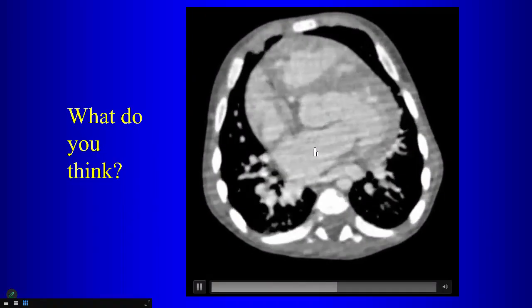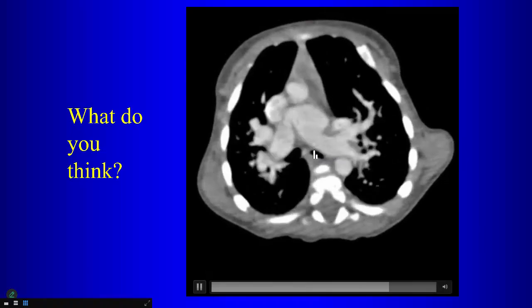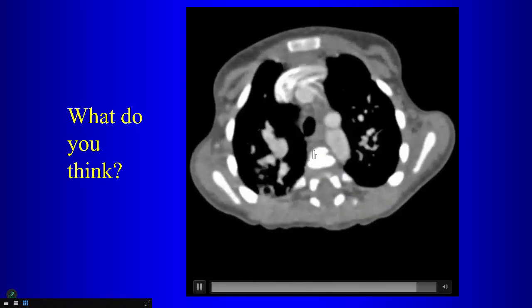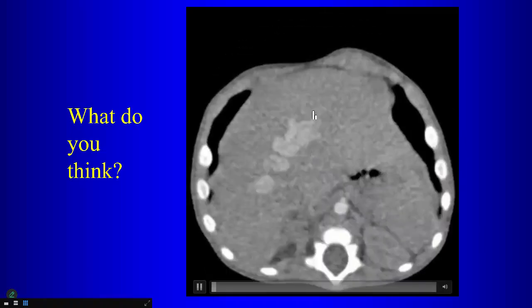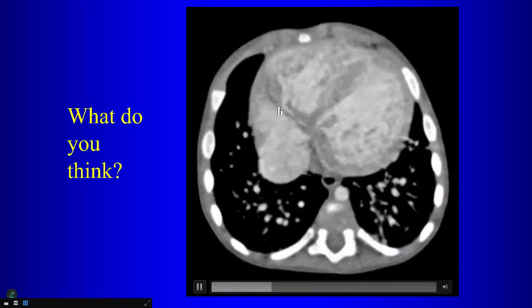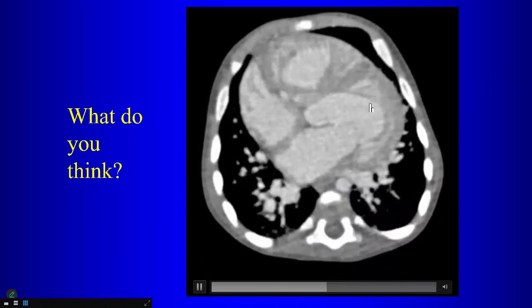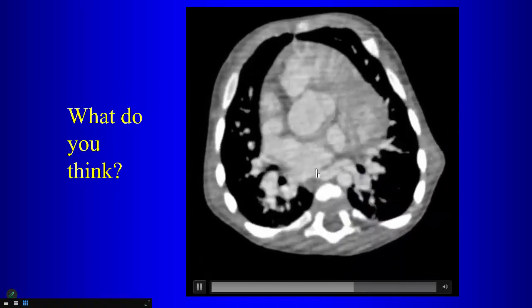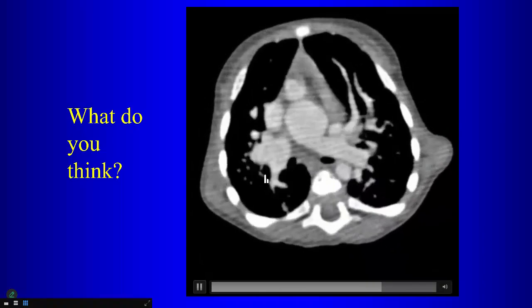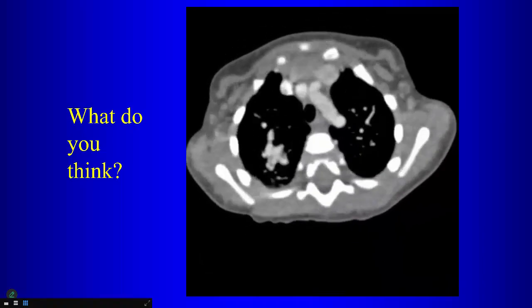Left atrium. Right, that's going to be the left atrium. Once you've identified the atria, the next thing to do is to look to see what chambers those connect to. So the IVC here is taking us to the right atrium. What chamber is this? Right ventricle, and this will be left ventricle. Right.